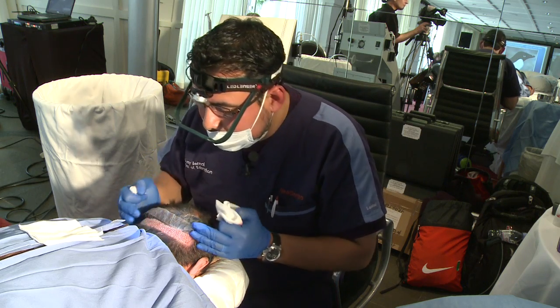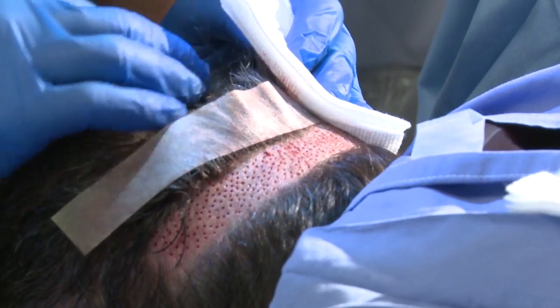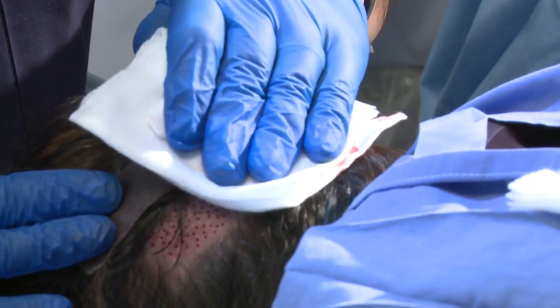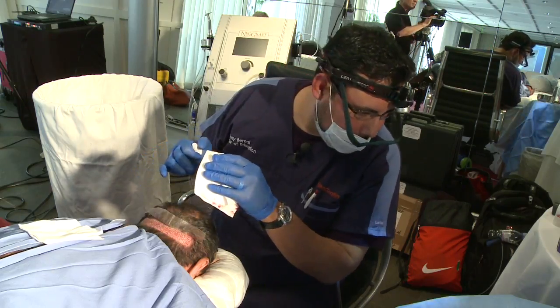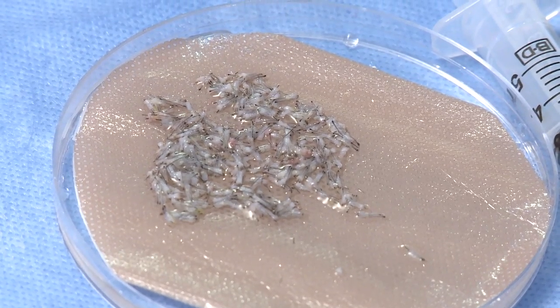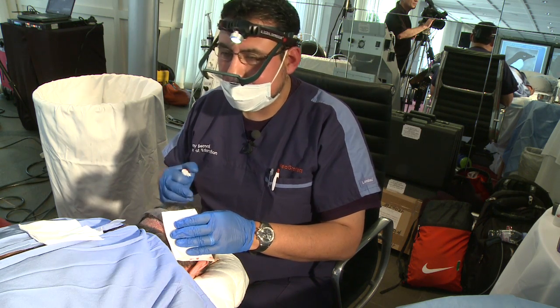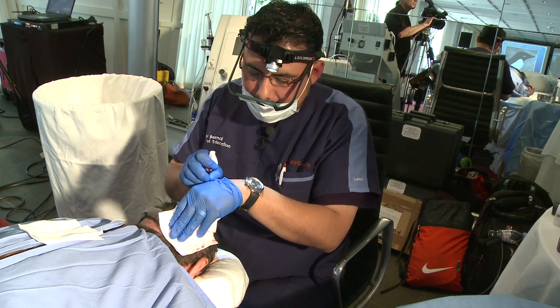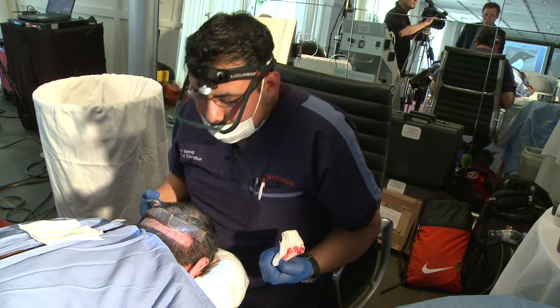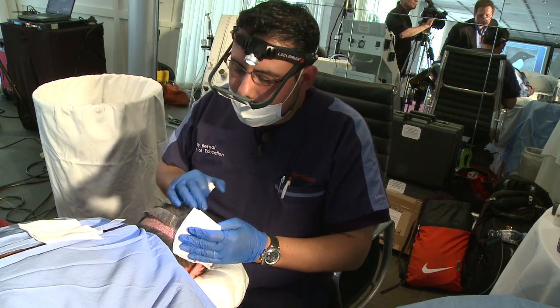I've basically completed harvesting this donor site that we designated to be the donor site, and pretty much I've skipped around taking every, say, fourth hair. We've got 332 follicular units. In these units, there's going to be follicular units that contain one hair, two hairs, but he actually had a significant number of 3 hairs, Maurice did. So that's going to help our cause in an effort to try to populate the crown area and provide him with a little bit more density here.